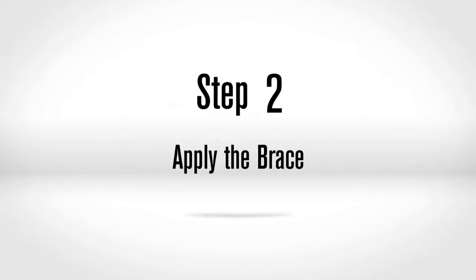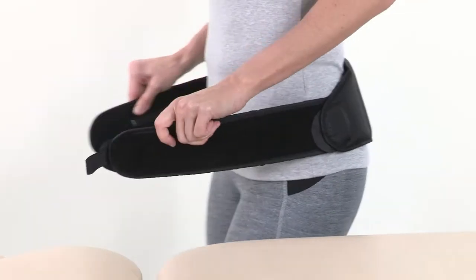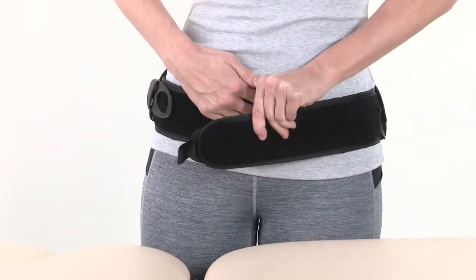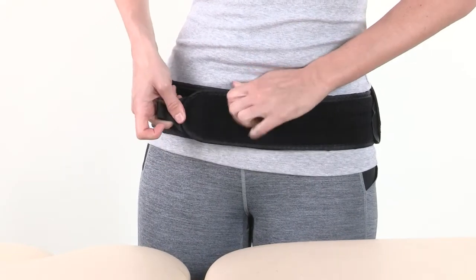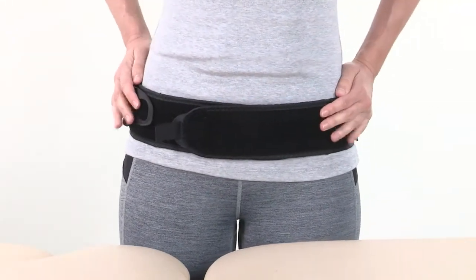Step 2: Apply the brace. Center the rear panel section at the midline so that the belt is just above the crease in the buttocks. Wrap the belt wings in front approximately 1 inch or 2.5 centimeters above the widest part of the hips and secure the hook and loop.